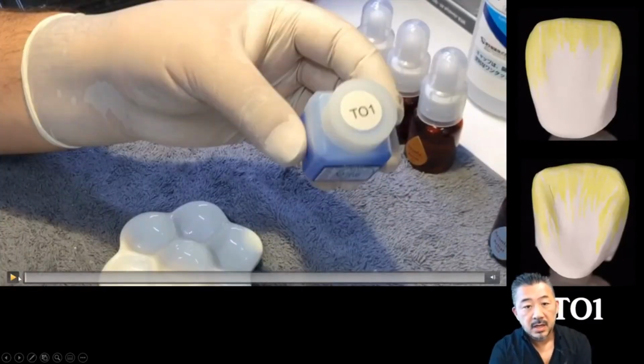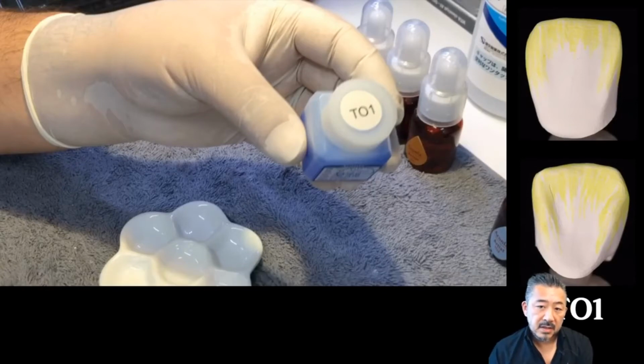Sorry. Before I get started, there is something I want to say. The first 4 steps are required only with a TT white disc, TT white, not TT multi-layer. I'll explain why later. I think the painted part is hard to see in the video, right? So I also display the crown painted with the color on the right side. See? That is a yellow color.